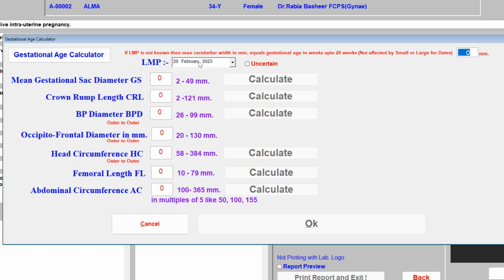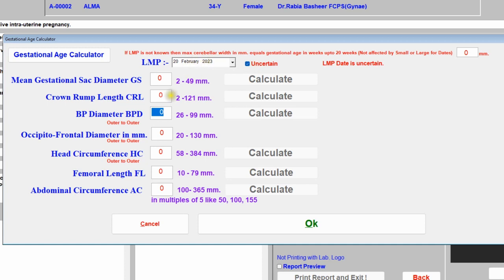If the patient doesn't know her LMP, you can click 'Uncertain' — this means the LMP date is uncertain. Otherwise, don't check it and enter the date by selecting from this area. Once you click 'Uncertain', you can then enter all the parameters: gestational sac diameter, crown-rump length, BPD, occipito-frontal diameter, head circumference, femur length, and abdominal circumference.